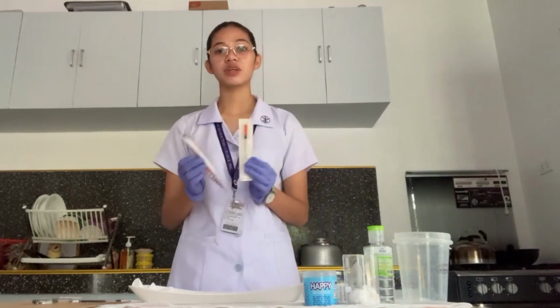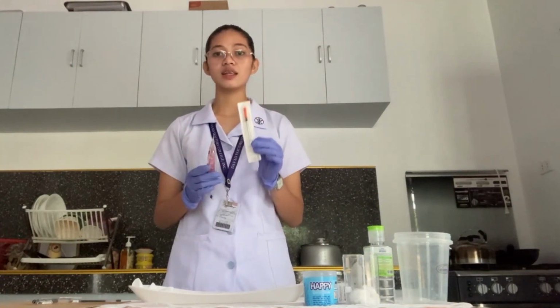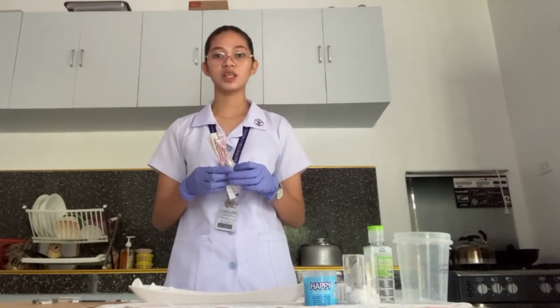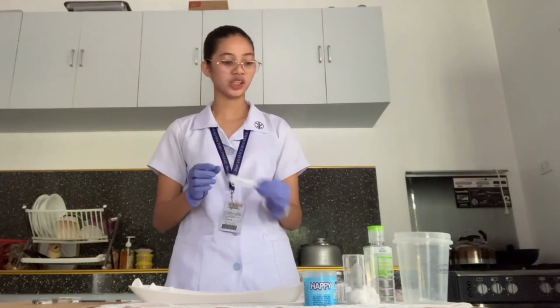After donning our gloves, we're going to organize our equipment. Now, the equipment that we will be using are, we have here the syringe. We have two syringes. One is used for our subcutaneous way of medication, and the other one is used for our intramuscular medication. We also have an extra syringe. This will be used for the actual administration of our medication.